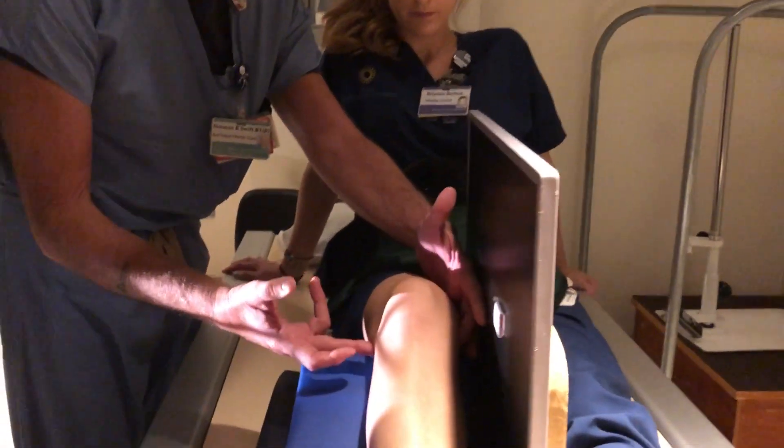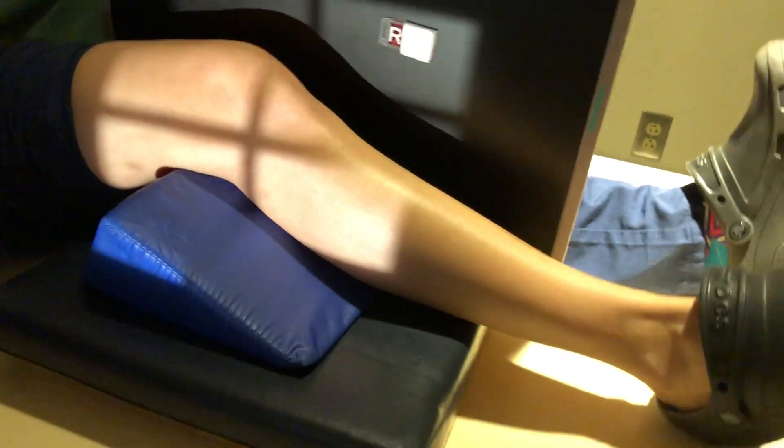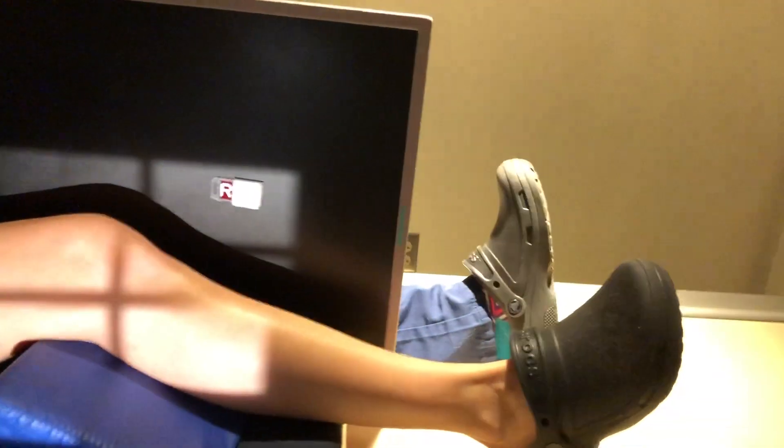Again, we're still going to feel for the condyles and make sure they're perpendicular to the IR. We're still going to center a half inch below the apex of the patella. Here's the patella, here's our central ray. Make sure the leg is perfectly straight from hip to ankle — that's the main thing to do in this view.